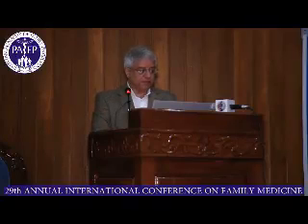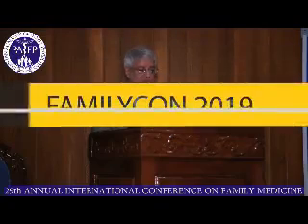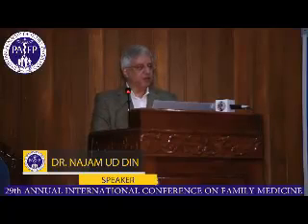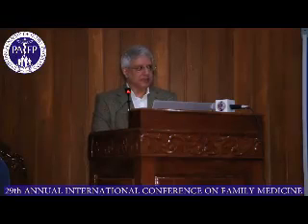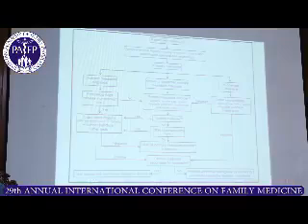CT is preferred mostly for trauma, so fractures in acute state, acute hemorrhagic, subarachnoid, or intracerebral hemorrhages. So these patients will either present with stroke or without stroke, but they have a peculiar, typical thunderclap headache, which will force you to refer them for CT more than MRI, and you want something done very quickly. So CT is much quicker than MRI for unstable patients. And same stands for paranasal sinuses and other diseases. CT is mostly used and preferred by the clinicians who eventually will offer them surgical intervention.